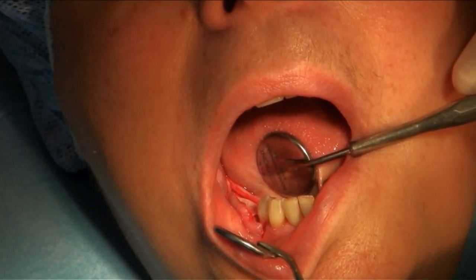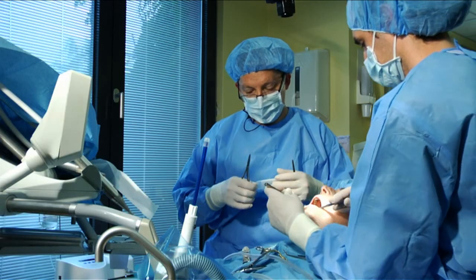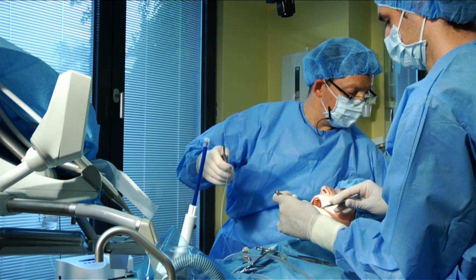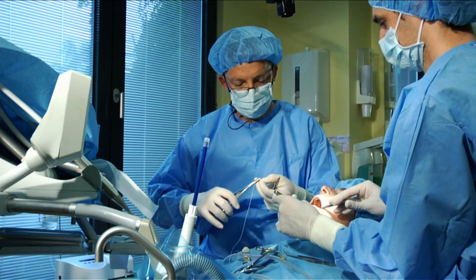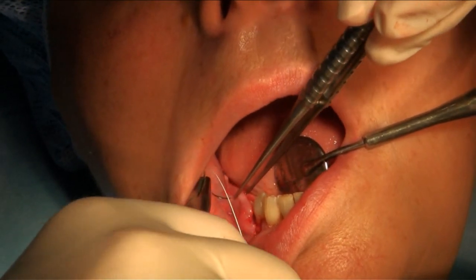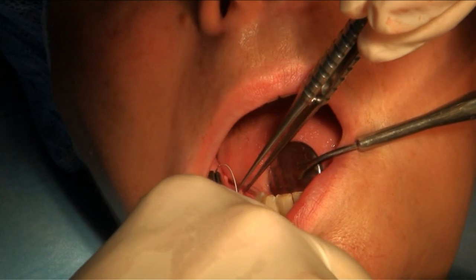And we suture now with, first of all, Gore-Tex sutures as horizontal mattress suture, and then additionally combined with single stitches.